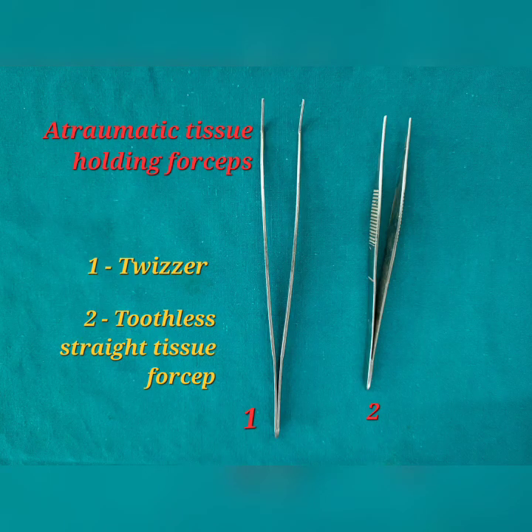Now let us discuss important practical points. First, always give nerve blocks. Don't infiltrate in or around the lesion. Local infiltration of anesthetic solution will destroy the tissue morphology of the lesion.